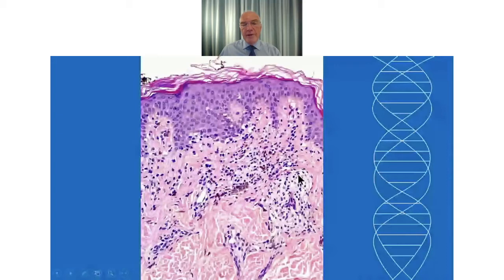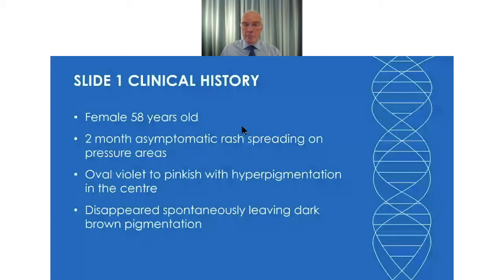Here we've got blood vessels in the superficial dermal plexus, and then the dots everywhere are mainly lymphocytes. This section also has some brown cells, and these are melanophages, macrophages that have taken up melanin as a result of something that's happened. We can see one or two other things. Some of the cells here have got clear spaces around them, white areas, so that's something we might look out for. And so let's have a look at the first case.